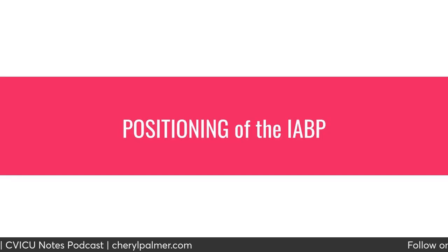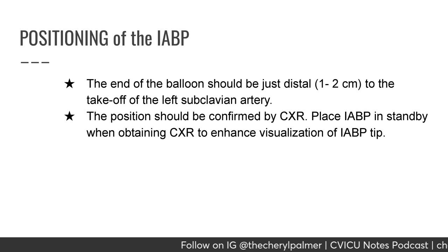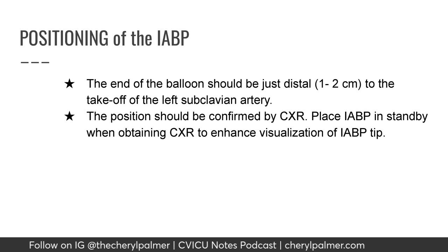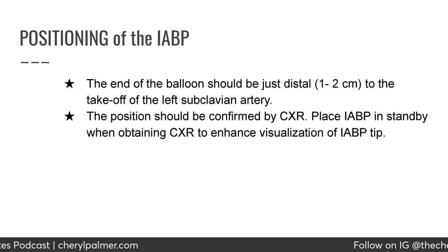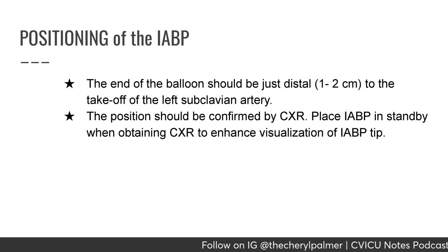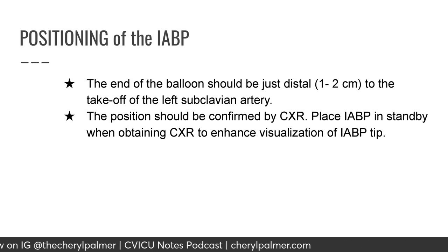Positioning of the balloon pump. The end of the balloon should be just distal, 1 to 2 centimeters, to the takeoff from the left subclavian artery. This position should be confirmed by chest x-ray. Place the IABP in standby when obtaining the chest x-ray to enhance visualization of the balloon pump tip.